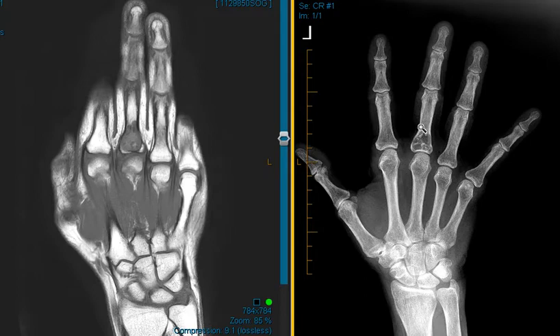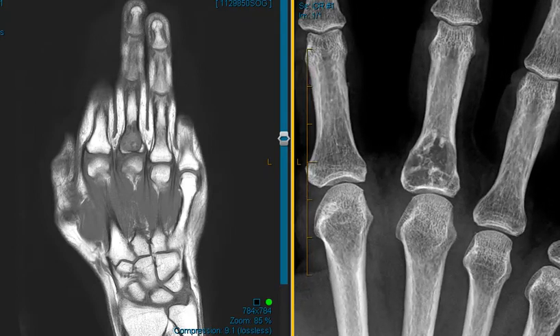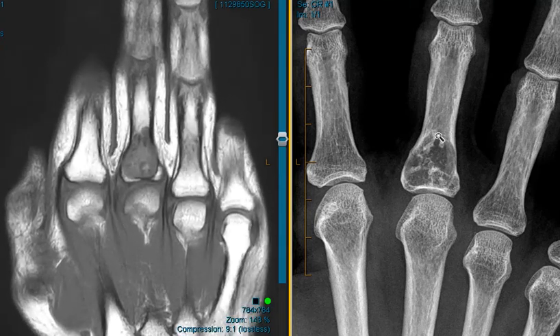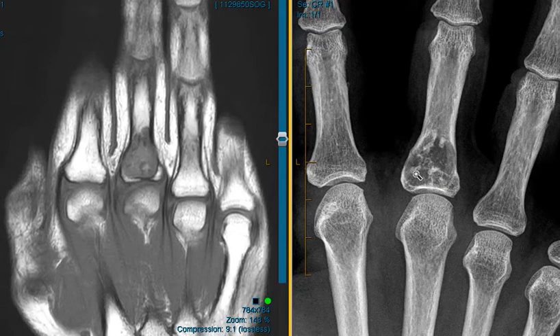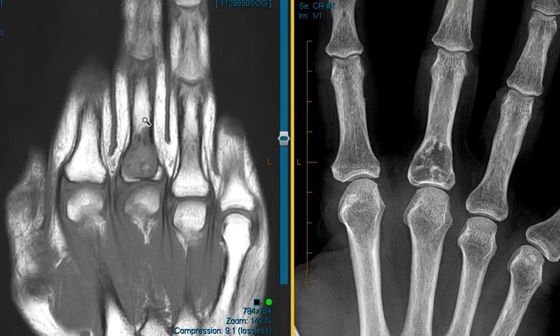On this x-ray, we saw a benign bone lesion discovered incidentally. We can see that the margins are well defined, with patchy areas of bone sclerosis. The inner margin of the cortex here is scalloped — called endosteal scalloping. It's not really significantly expanding the bone, and there's no fracture.